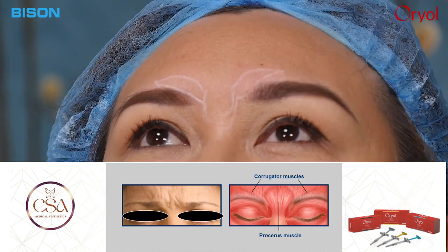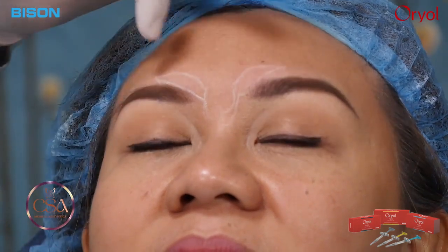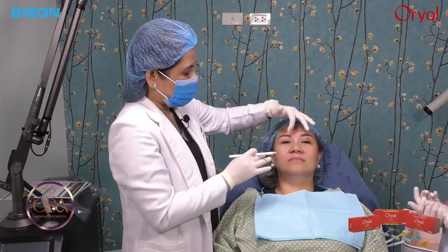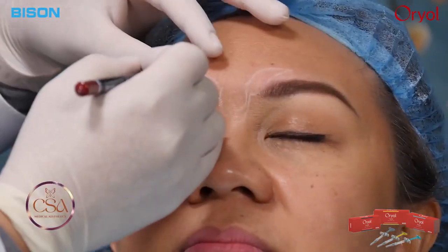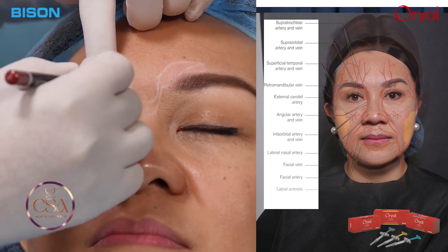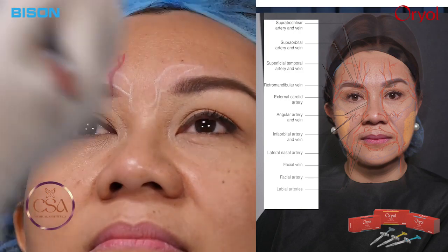And then the important thing that we have to master, okay, there you go, master, when we do filler injections will be the blood supply in the area, okay? So we physicians are avoiding the blood vessels in the eyebrow area, the medial supraorbital aspect here. So we palpate for this, the supraorbital foramen. This is where your supraorbital artery and vein come out, okay? And the supraorbital nerve comes up. And then medial to that, about 1 cm, we have your supratrochlear vessels, okay? So these blood vessels are danger zones, danger areas. Same thing on the other side.